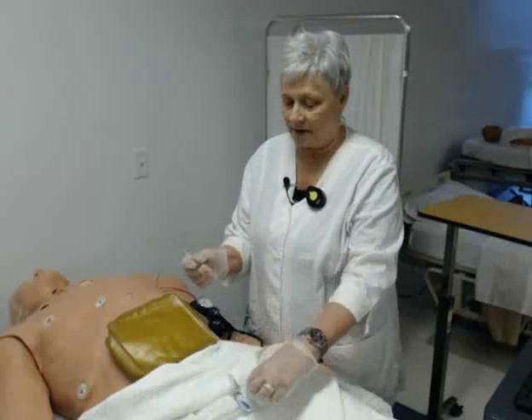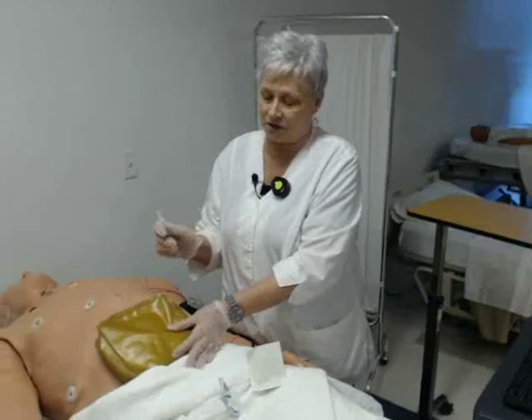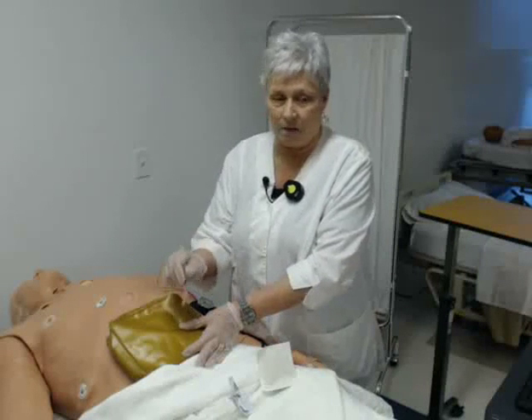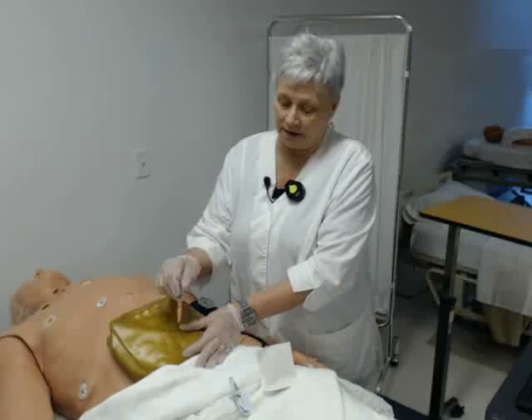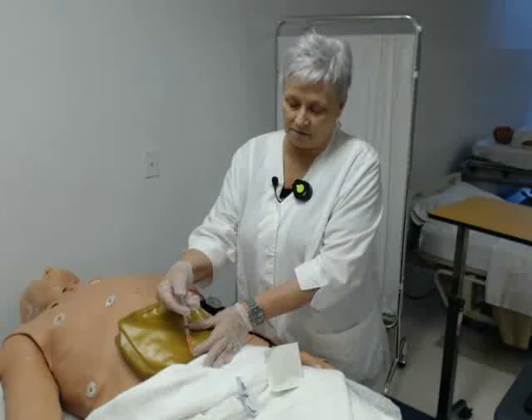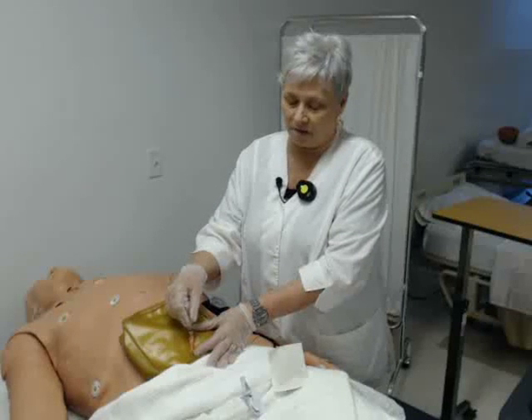Then I'm going to pull my cap off my needle straight off. I have a safety needle and I'll engage this immediately after the injection. I'm going to pinch up a little bit because this is a sub-Q injection. I'm going to go in at 90 degrees, holding my syringe like a dart — always like a dart — you have a lot of control over it that way. I'm going to insert the needle all the way in. I'm going to go in gently but quickly. I'm going to give the medication slowly. Then I'm going to wait a few seconds — I believe the book says 10 seconds. Then I'm going to not massage or anything.